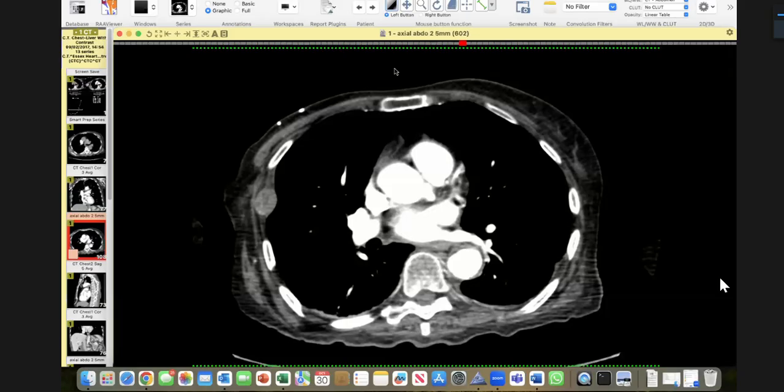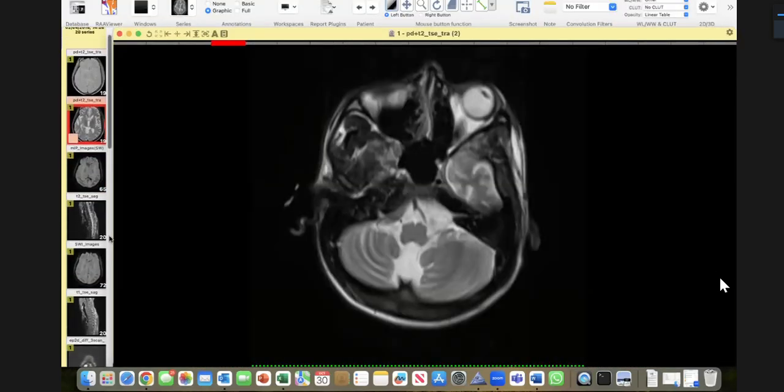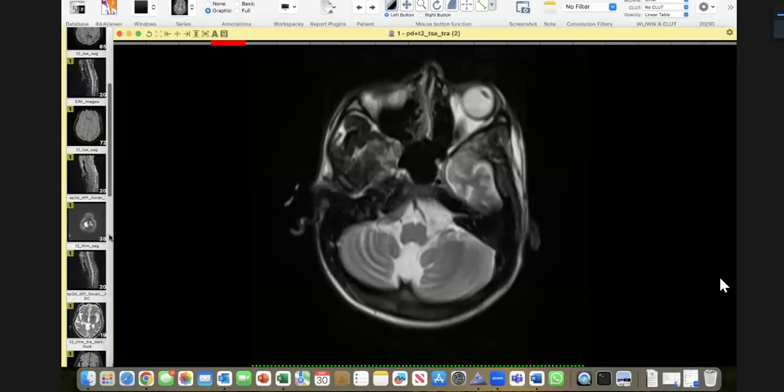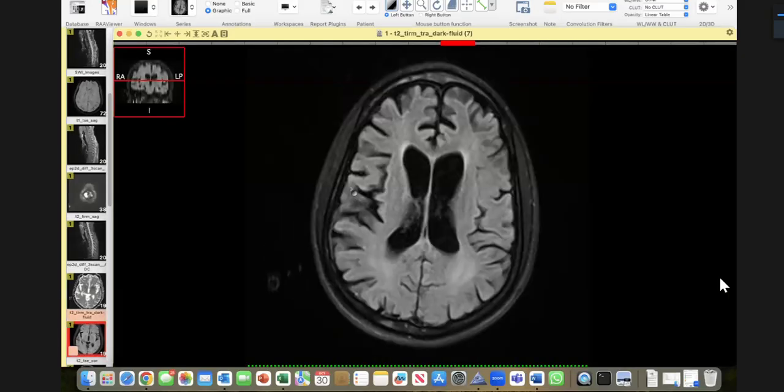If you start going into too much detail, you don't have the luxury to do that. And take hints. When an examiner gives you a hint, you have to take it. Now, in this particular case, your thought process was very good. I liked this. 20 years old, I gave you a history that has got backache, etc., for five days at home. So your observation was good about atrophy.